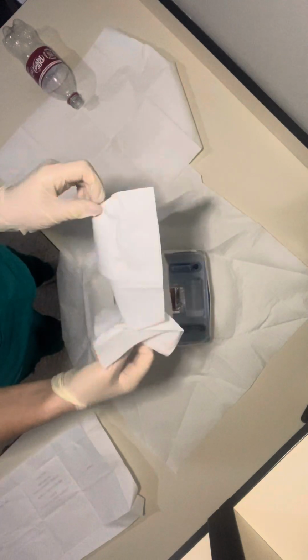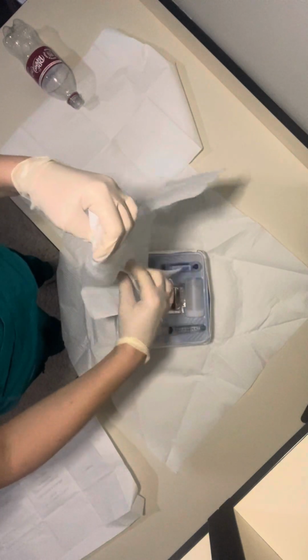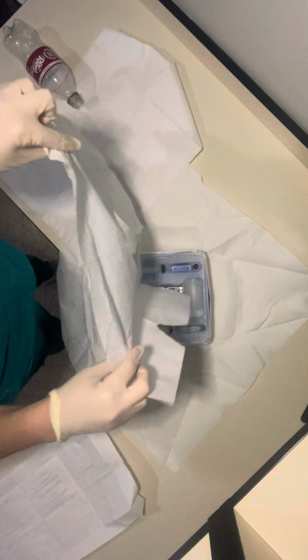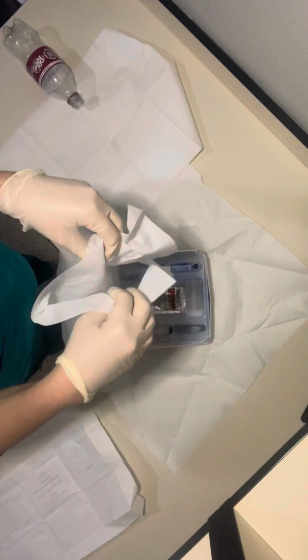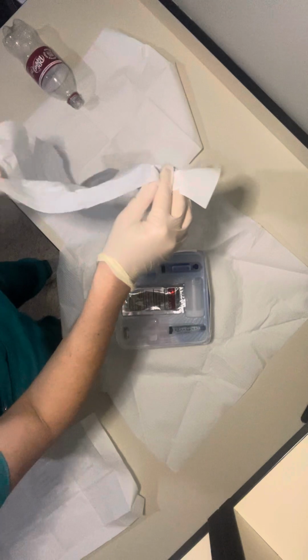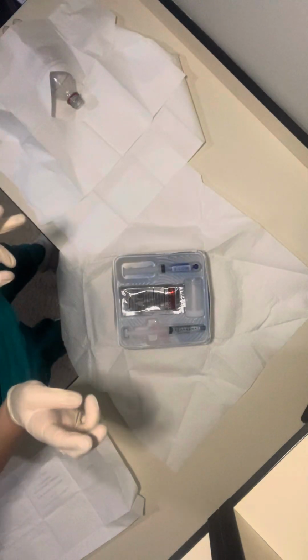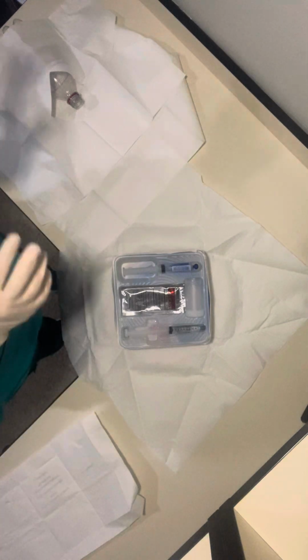Okay, and then this one. Oh. I wouldn't let it fall like that. So because I contaminated, I would discard and get a new one. But for the video, I'm just going to keep going for the video's sake. Okay, and then you would just drop it. You wouldn't touch the patient.